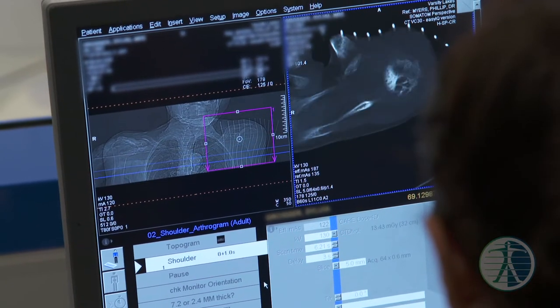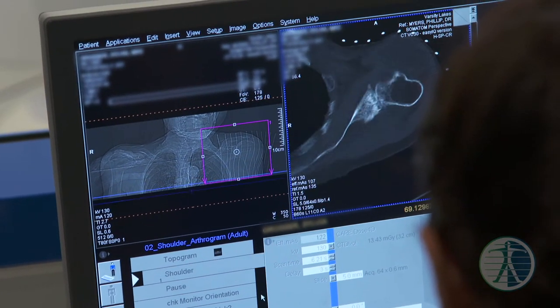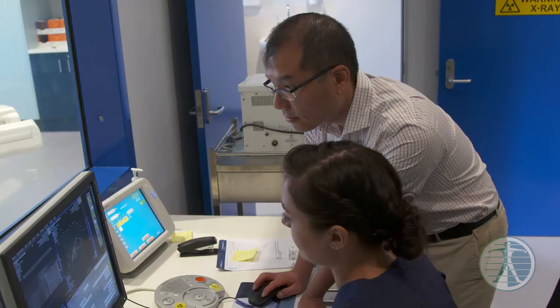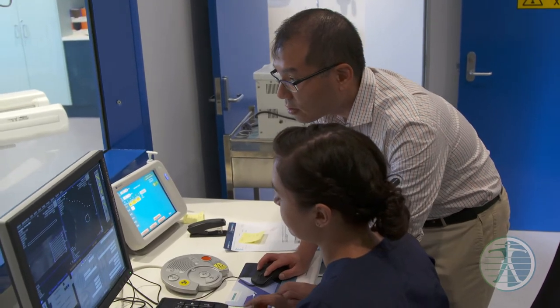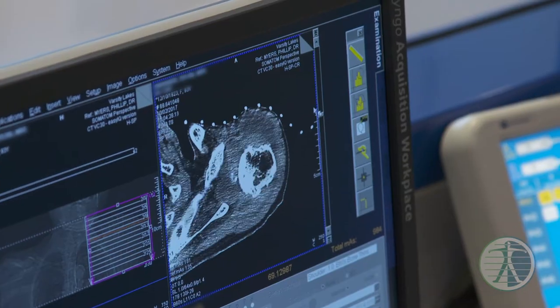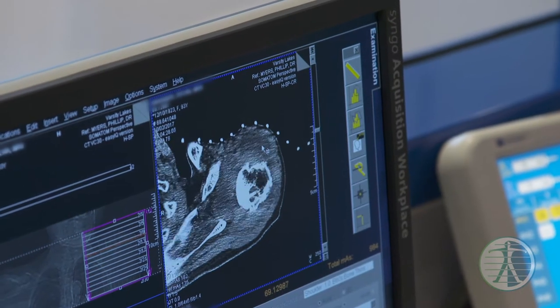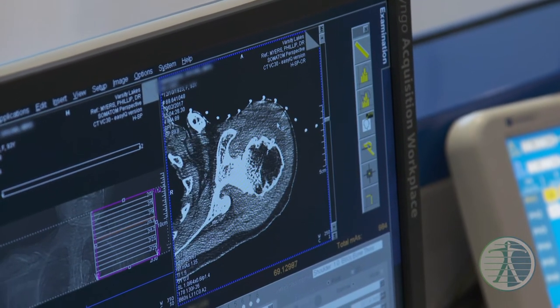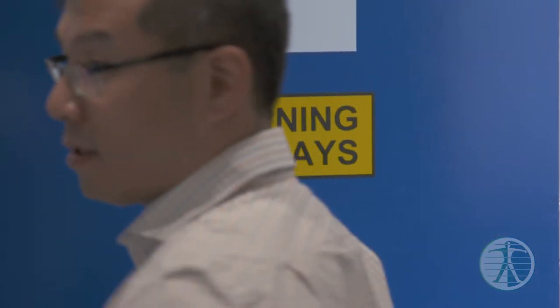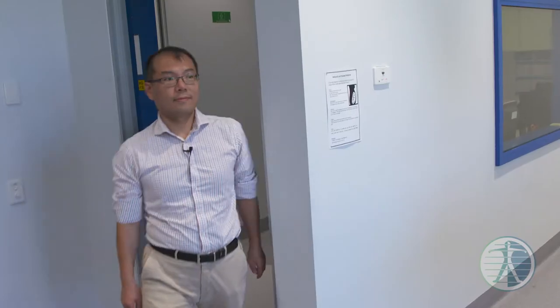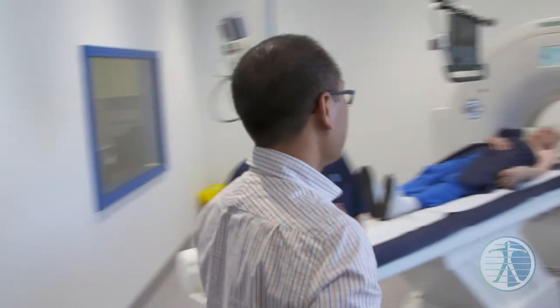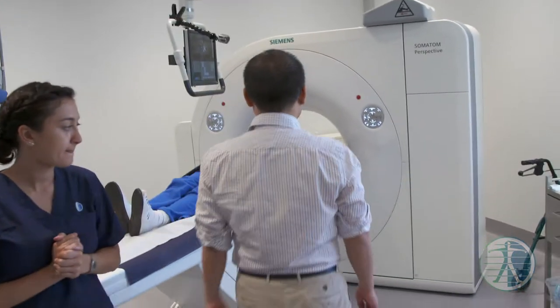There's a large effusion in there — lots of arthritis, but large effusions. Using CT as a guide, we're going to identify the location where we want to inject the shoulder joint.